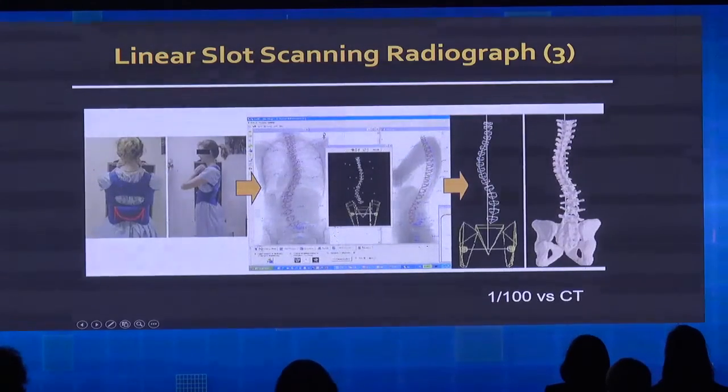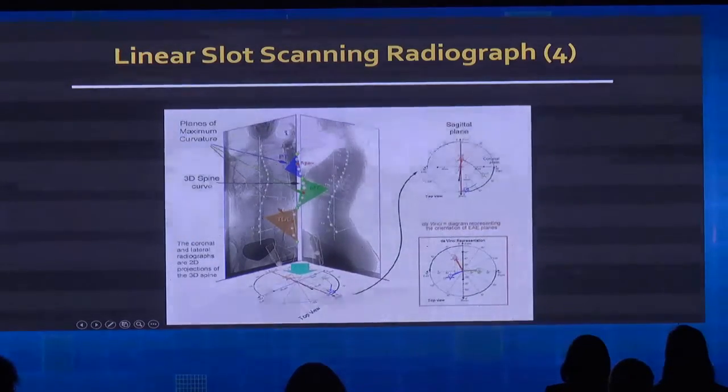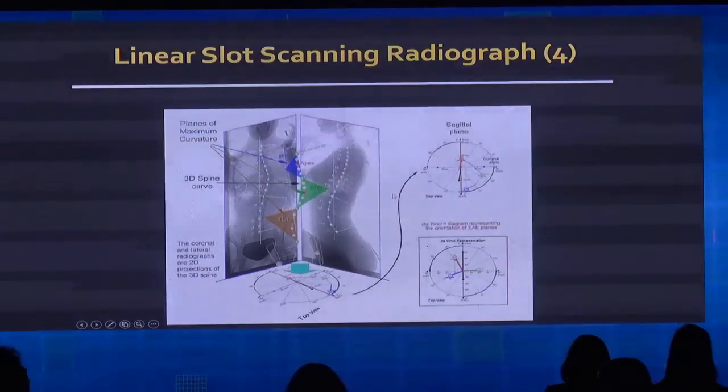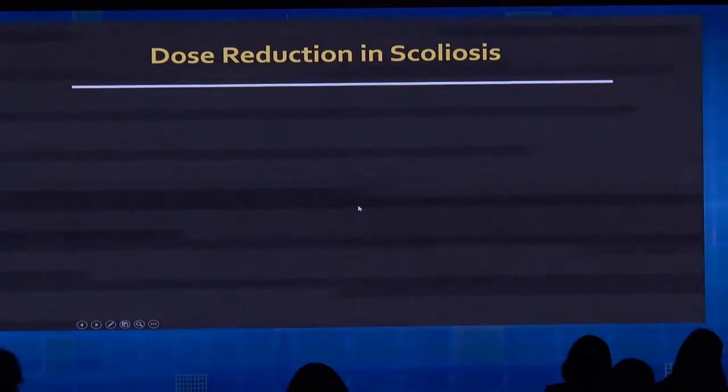So you have the patient. This was classic. You get this kind of reconstruction, and then finally you have your model. The surgeon can have whatever he wants in the way he wants. He can make as many indices of rotation that he like, because before, now they are very excited because before they were strictly unable to do that.